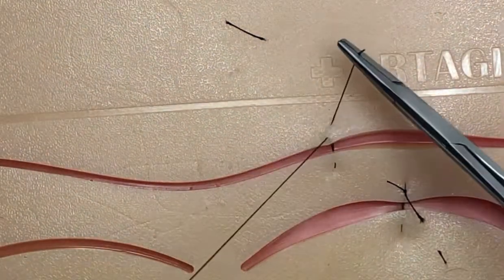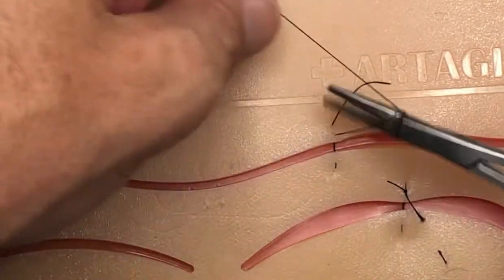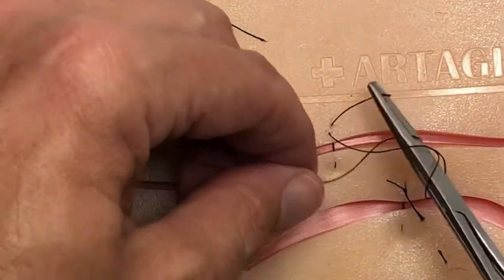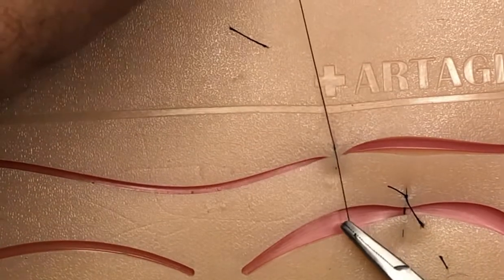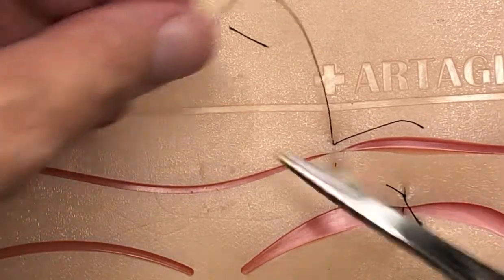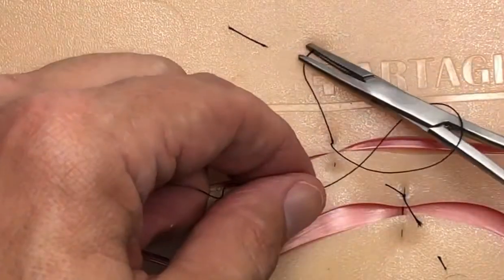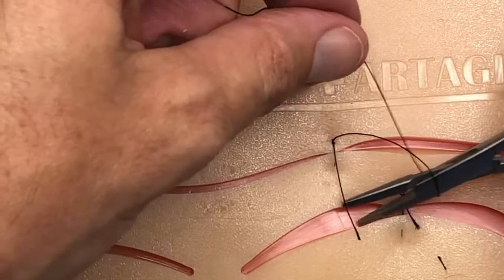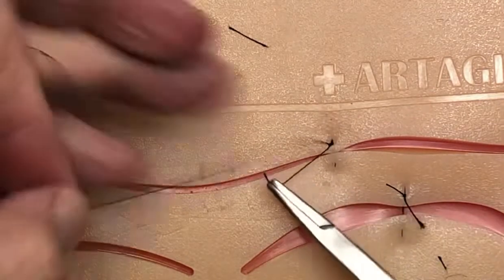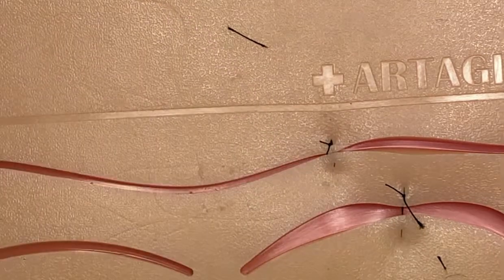We're going to do our standard instrument tie with two throws — pull it nice and tight, snug — and you're able to get good re-approximation of the edges. Remember, whenever you're doing your instrument ties, every single time you go in the opposite direction. That allows the knots to lie down nice and square and they won't slip. Usually tying anywhere from three to five throws per suture.